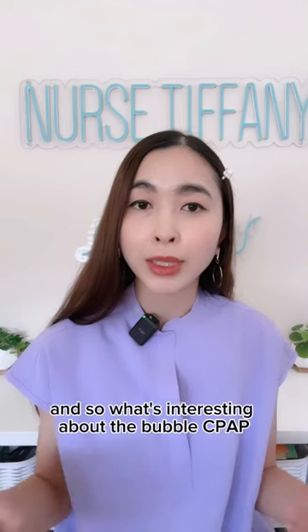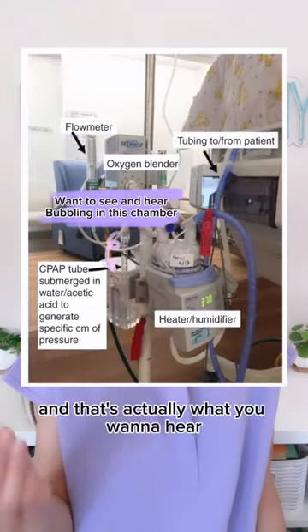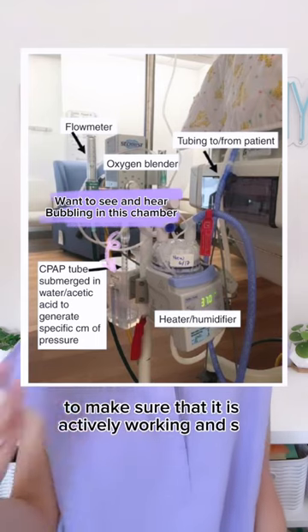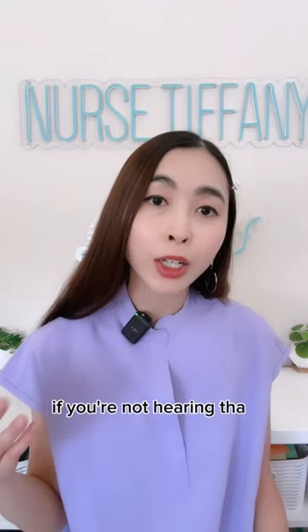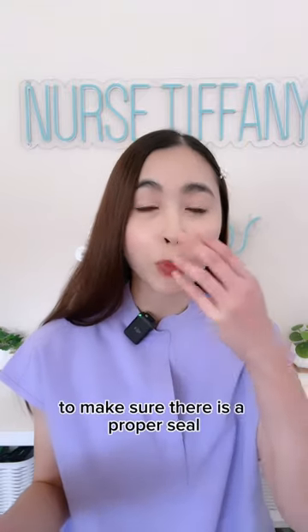Something you want to know about the bubble CPAP is that there is bubbling in it, and that's actually what you want to hear to make sure that it is actively working. If you're not hearing that bubbling from the machine, then you want to check on your patient to make sure there is a proper seal.